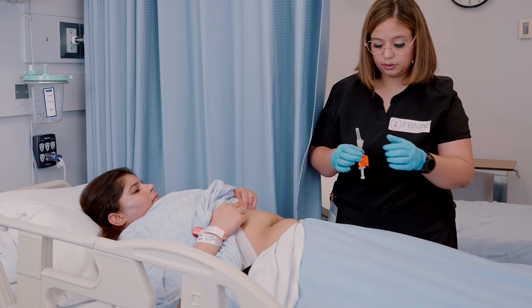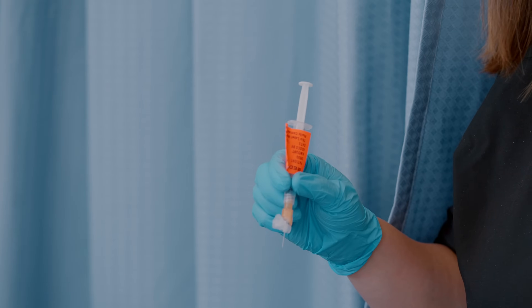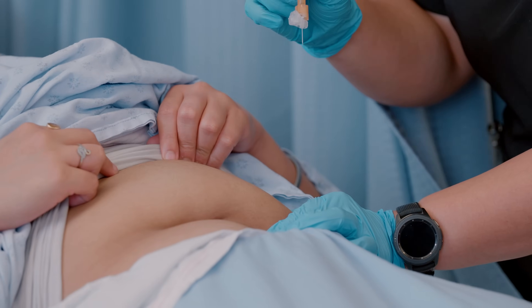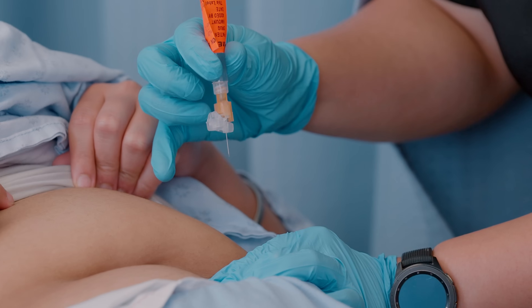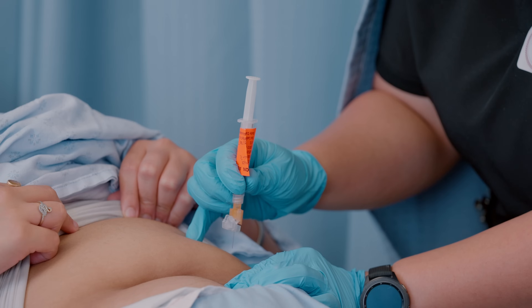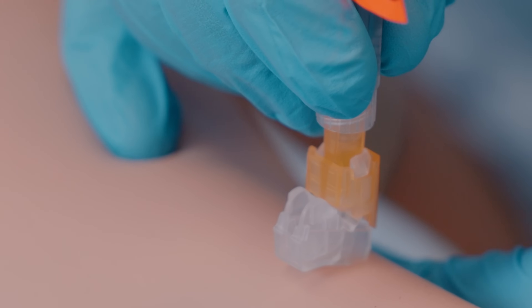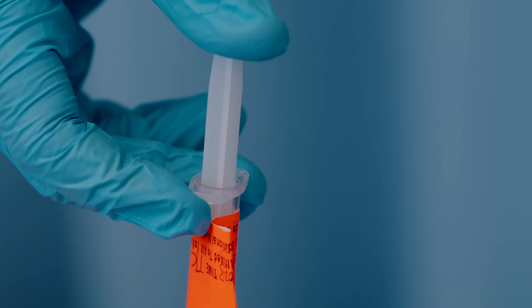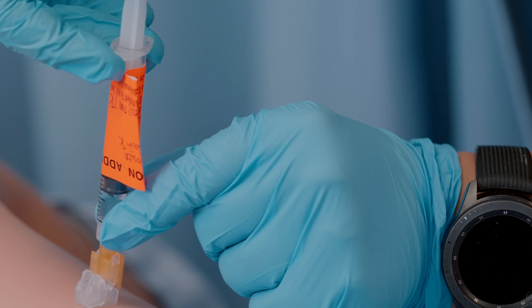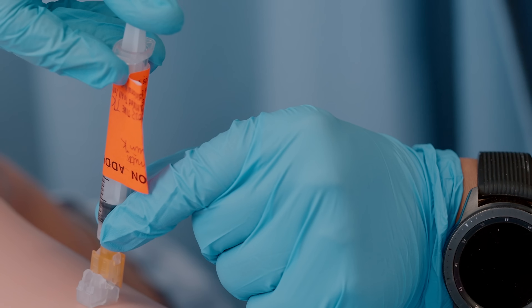When you are ready, remove the needle cap or protective sheath on the syringe by pulling it straight off. Hold the syringe between the thumb and forefinger of your dominant hand as if holding a dart. If your patient is of average size, hold the skin across the site or pinch a fold of skin with your non-dominant hand. Insert the needle quickly and firmly at a 45 to 90 degree angle, then release the pinched skin and use your non-dominant hand to stabilize the syringe. If using an injection pen or giving heparin, continue to pinch the skin during injection. If your patient is obese, pinch the skin and inject the needle below the tissue fold at a 90 degree angle.